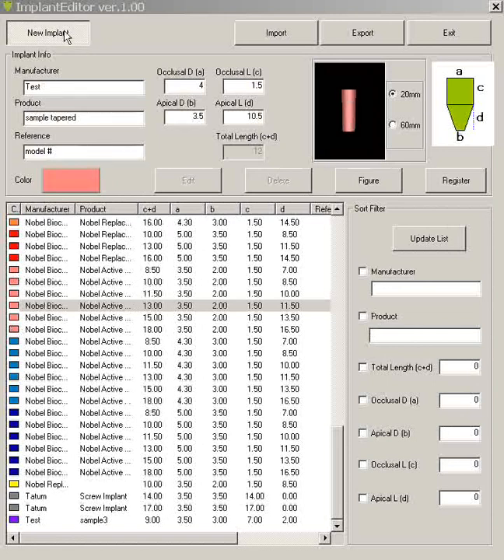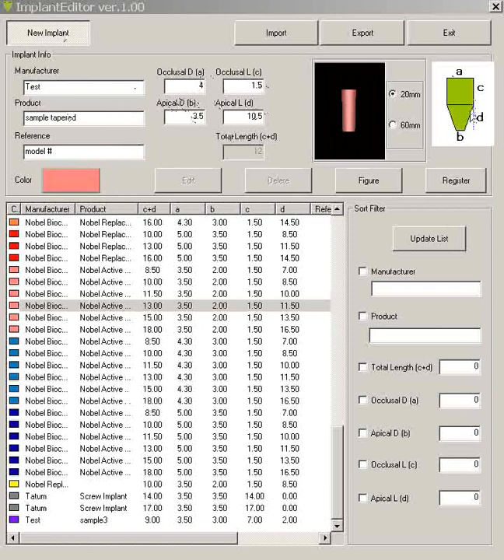So we hit new implant. And we filled in all these areas. Filled in the name, product type, model number, filled in all the parameters A through D. And then we can even change the color if you wish.